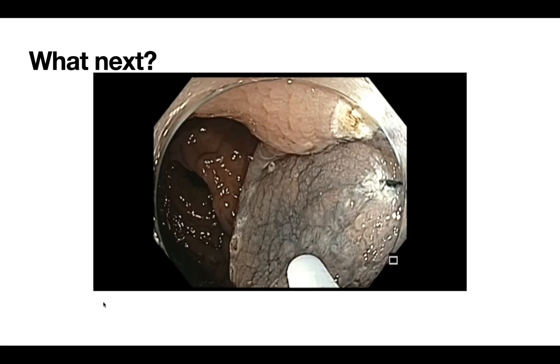Right. So my thought process when I started assessing the lesion and cutting was that the sessile component was certainly an adenoma, and the flat component surrounding this area was probably hyperplastic. But at the same time, I was not sure. Are we sure it is hyperplastic?